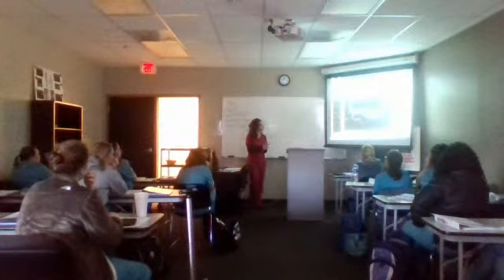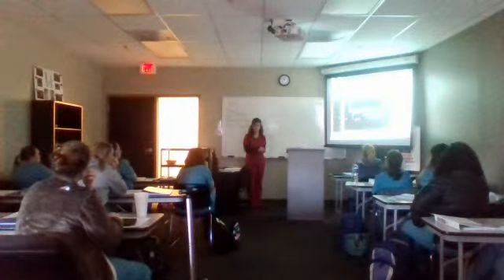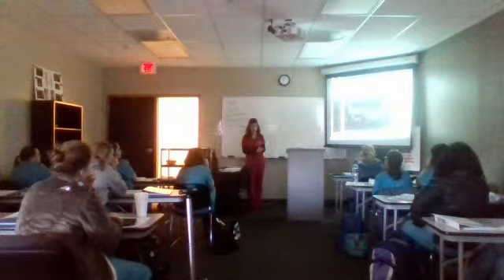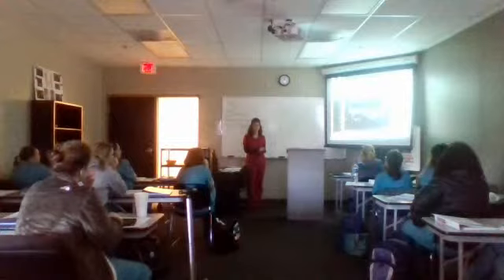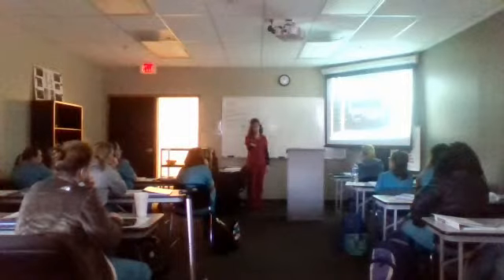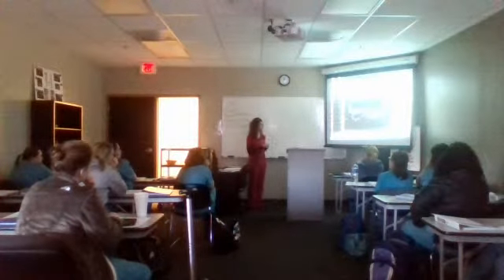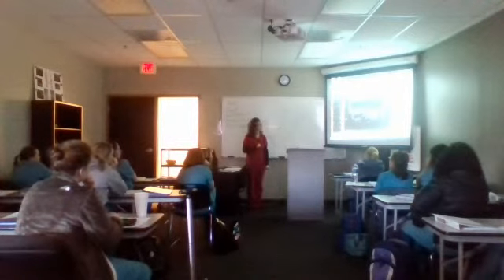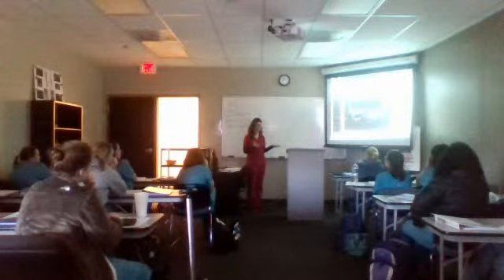So, should you compress and push down on a possible acute thrombus? No, because if you do, chances are it'll break loose and throw to the IVC. Where does the IVC go? To the heart, okay? So the very first thing you're supposed to do is put color on it first. If color fills in, you know there's no thrombus there, so you're safe to push down.